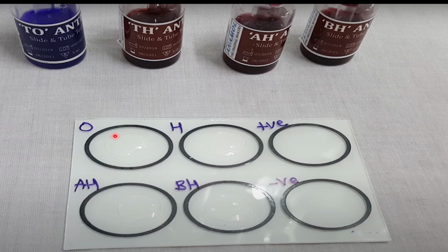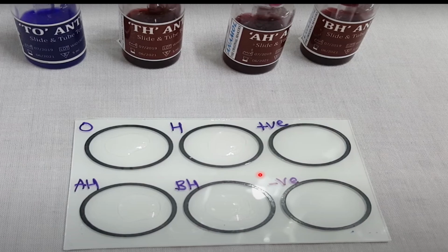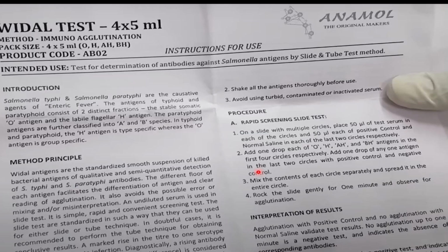So after this, what will you do? Take separate, like 6 sticks or something, and you mix this. After you mix this, what will happen? After you mix, you do something called rocking. Rock this slide gently for 1 minute and observe the agglutination.